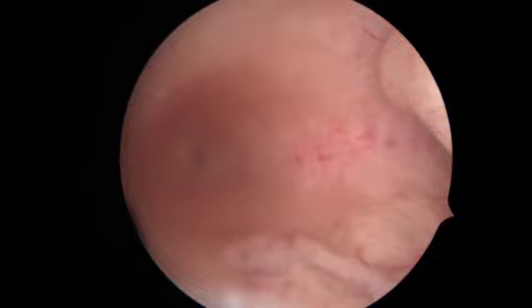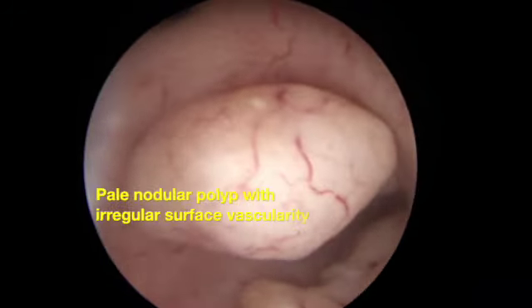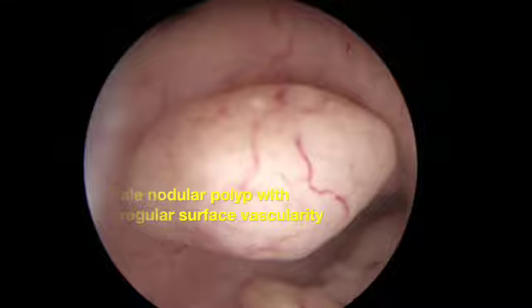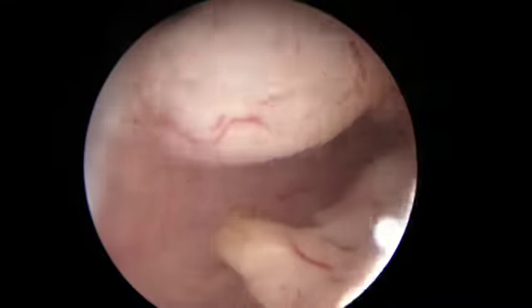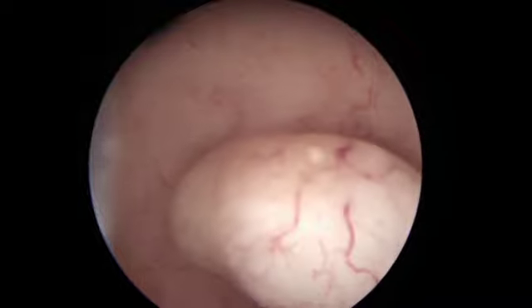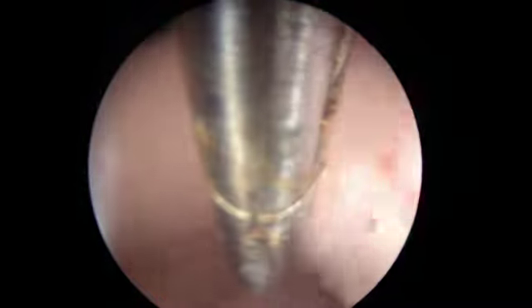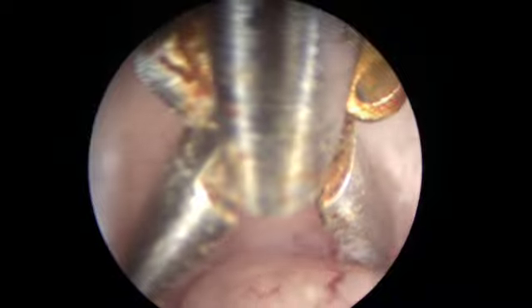You are seeing the right ostia very clear; the left ostia cannot be seen clearly. As you examine the growth, you will see it is pale, with a nodular, irregular surface and vascularity. Similarly, on the posterior side, you have scattered nodularity on the posterior wall. This typical appearance is like a cotton wool appearance.